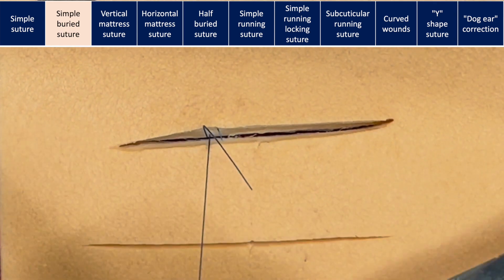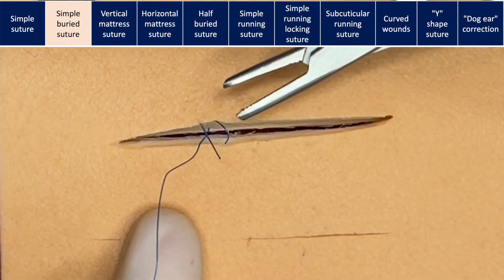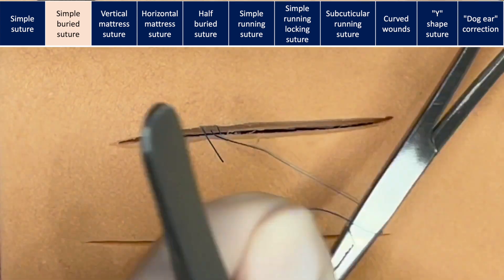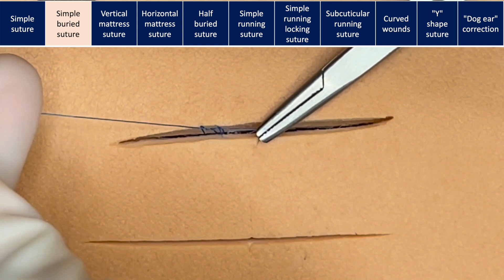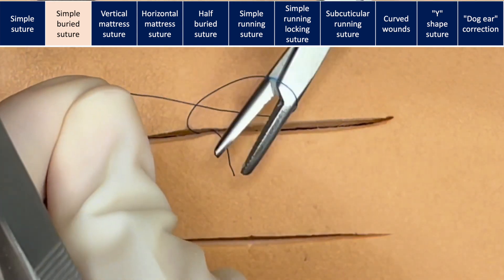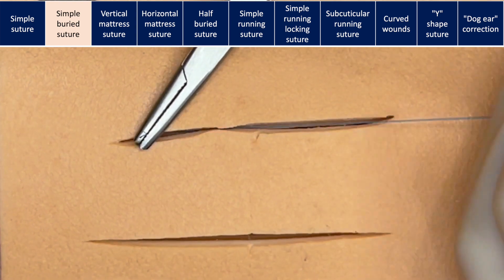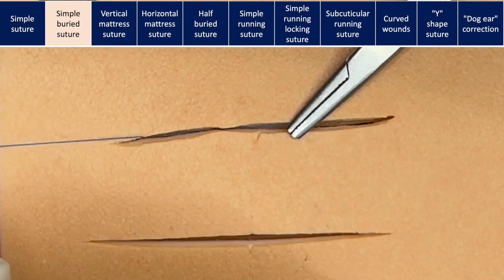At the end, both threads of the suture are now deep. It is important that both ends are on the same side of the loop. When tying the suture, we will gently pull it along the length of the wound. This method helps us reduce tension on the skin, making it easier to bring the wound edges together and achieve a nice skin closure.